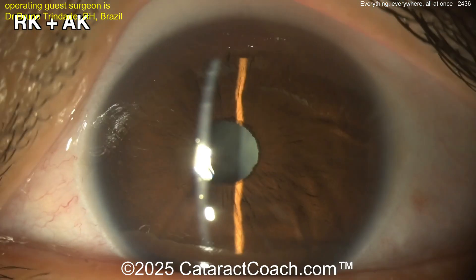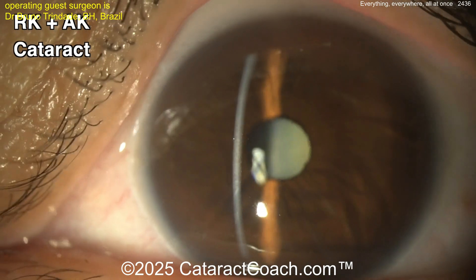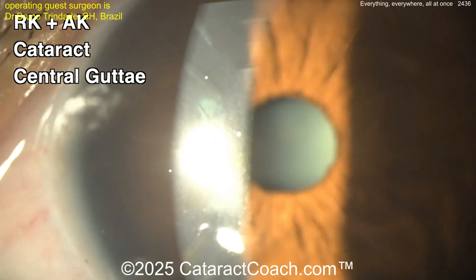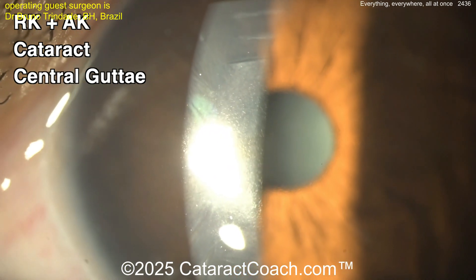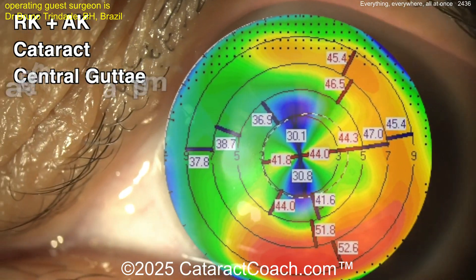Those AK cuts are causing a lot of astigmatism. It helped initially. Here's the left eye now — look, it has nuclear sclerosis as well, you see the NS there. It has the RK cuts, and it has all those AK astigmatic cuts too, plus it has central gutae — you can see that there on the central endothelium.